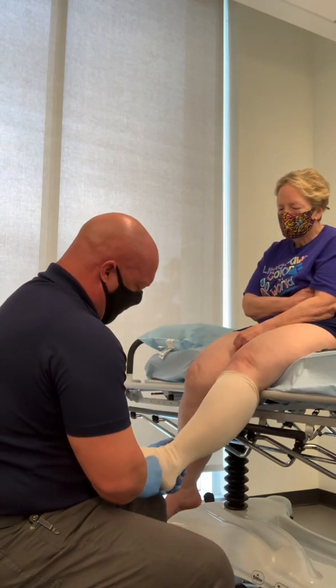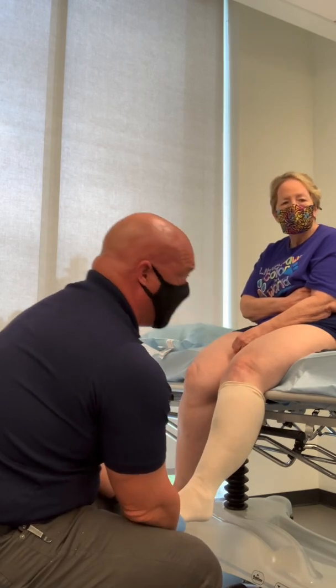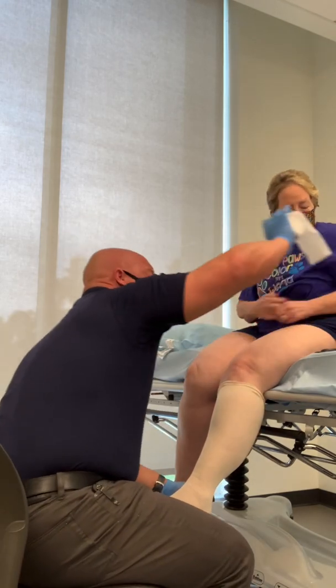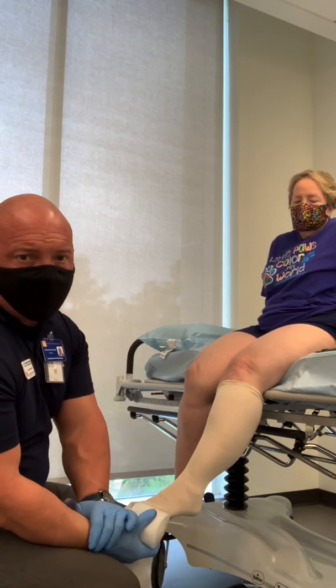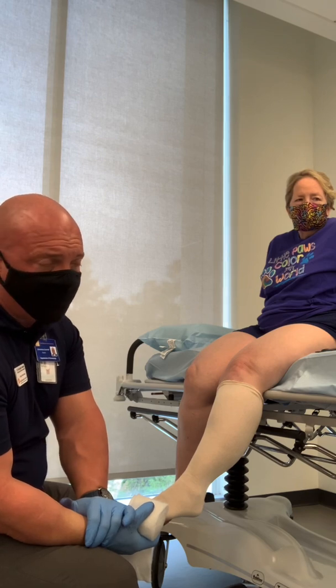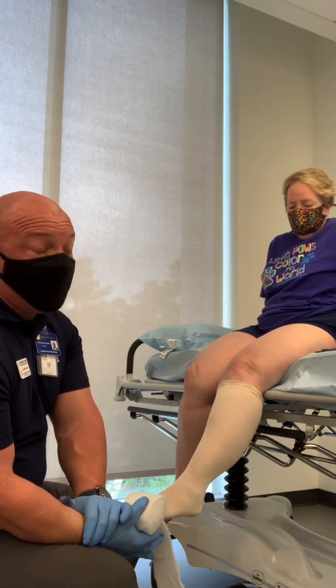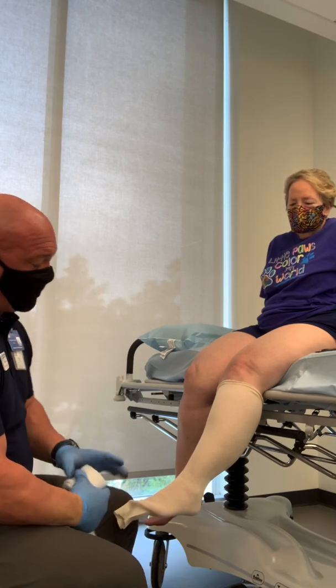We're going to have the patient in a relaxed position to begin with. Because unlike a short arm cast, it takes quite a bit of padding and quite a bit of contouring to do a leg cast correctly. So again, be patient. There are going to be a few different techniques that I'm going to use in the wrapping procedure.